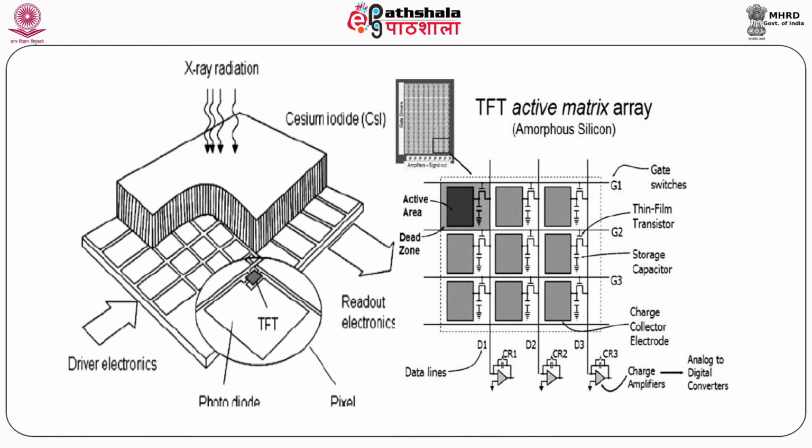So, the plate is exposed to very intense light, sodium light, which removes all the metastable electrons to their ground state, thus emptying most of the F center electrons, and therefore now the cassette is ready for use for another exposure. Otherwise, if this is not done, then some remnant image will be lying, which might produce an artifact known as a ghost image artifact. So the remnant image might be visible on the image.